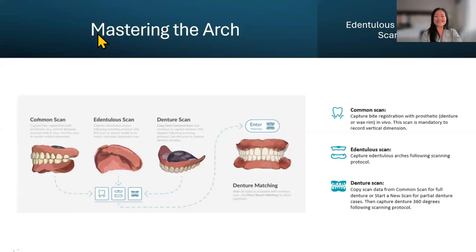Mastering the arch. It's time to get started. This is one of the ones that we get lots of questions for. We want to know the workflow, what goes first, what goes second, in what order. And we always say, Kelly, we should always have a conversation with our lab, right? Because it's a team effort, and there's so many scenarios. But I want you guys to look at this screen and see that within the software, there's only 3 pages that you can possibly use. You might use all 3, you might not, but there's just 3 pages.